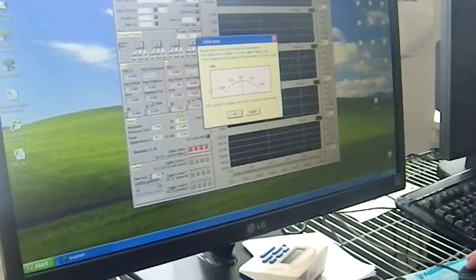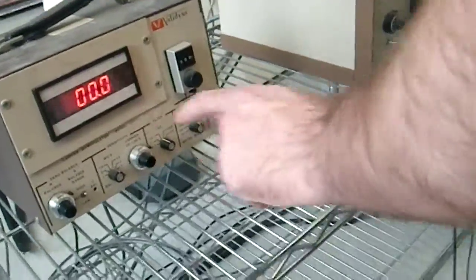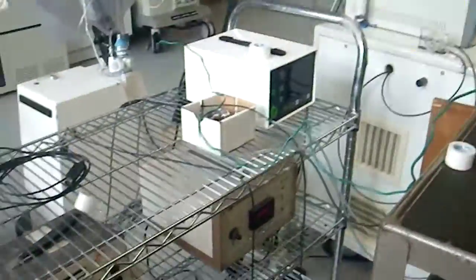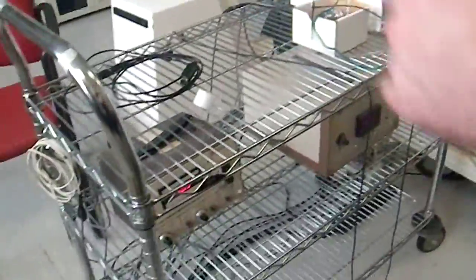So now it's going to try to measure the volume. So you have to make sure that these two machines are turned on in order for it to measure. So this one here is for power. Push that on. This number should be right at 0. Over here, this one's also on the far right at the bottom. So you just flip that on and you'll see the numbers. So this one's measuring flow, this one's measuring volume, and it sends the signal to that computer.